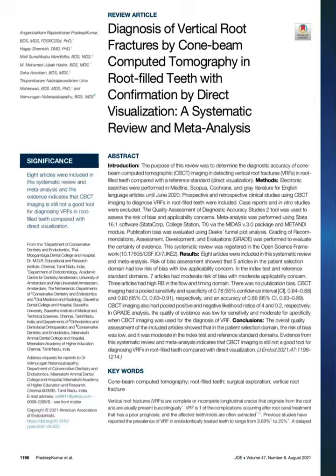The reference test, which is the confirmation of vertical root fracture, performed in the included studies was surgical exploration, tooth extraction, or orthograde retreatment. The results of the included studies are not consistent, and the CBCT diagnosis of vertical root fracture was based on different indicators, so the diagnostic parameters or indicators were not standardized among the studies.